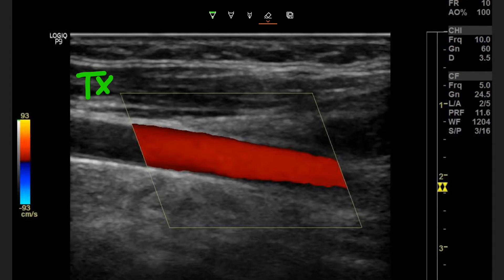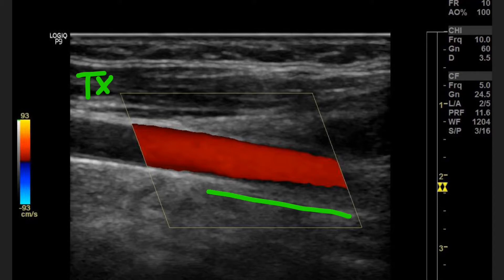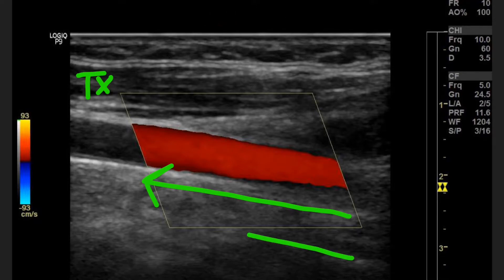So now we're going to look at the color inside of our vessel and our color map. We have red inside of our vessel, and we know that red is coming towards the transducer because red is at the top of our color map. The color at the top is going to be coming towards the transducer; the color at the bottom is going to be going away from the transducer. Since we're coming towards the transducer, the direction of flow is from right to left.